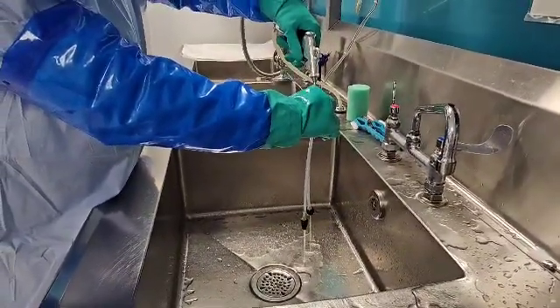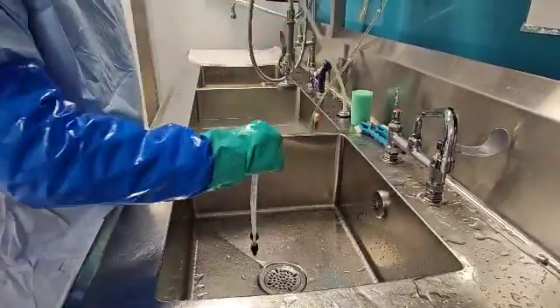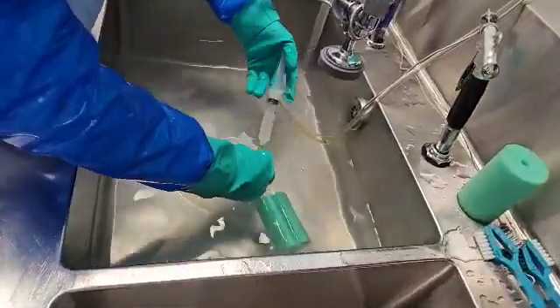First, we want to rinse the exterior and interior surfaces with utility water, as shown here. Next, we're going to go ahead and soak our device in the detergent of choice, but do not forget to prime your tubing.